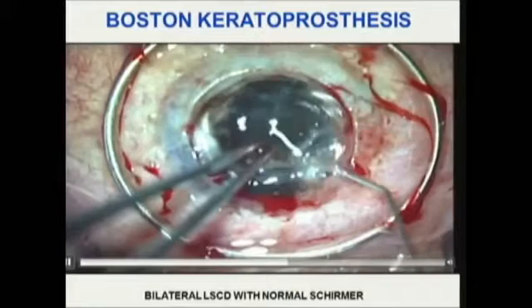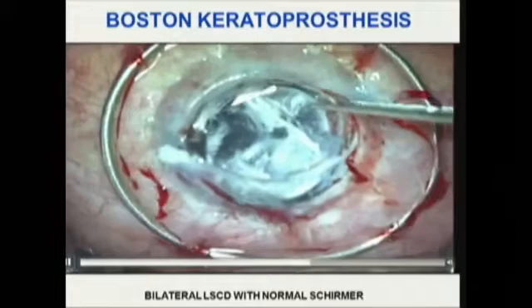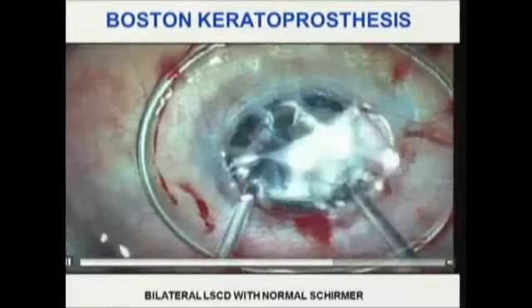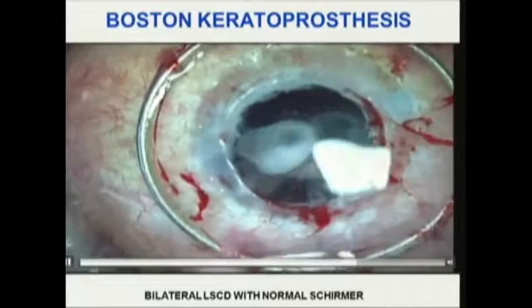And under Kenalog-assisted anterior and core vitrectomy, the Kenalog was injected. The capsular wall was also excised. Then an anterior vitrectomy, and also the core vitrectomy was done. A few drops of Kenalog were injected again in order to be sure of the success of the vitrectomy.